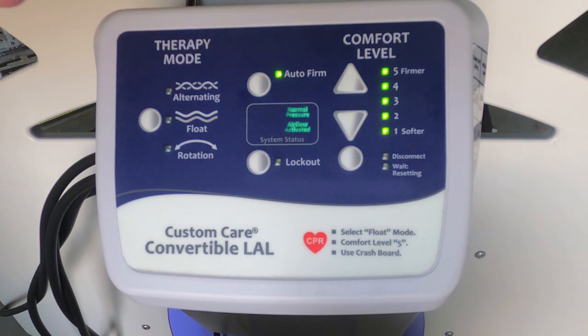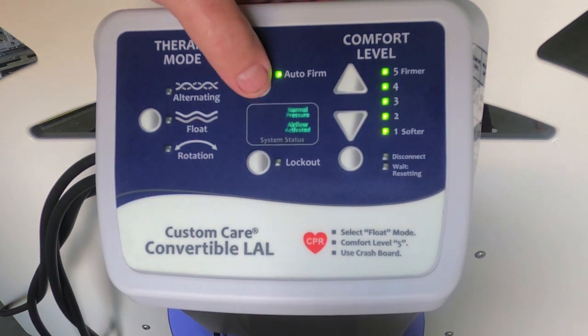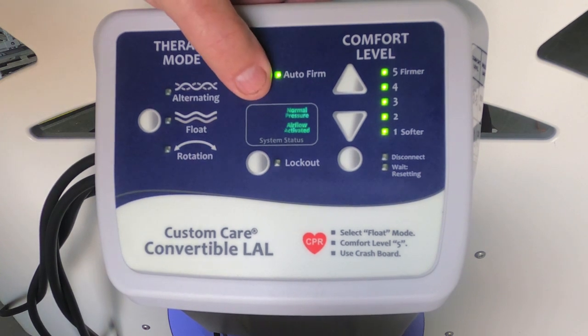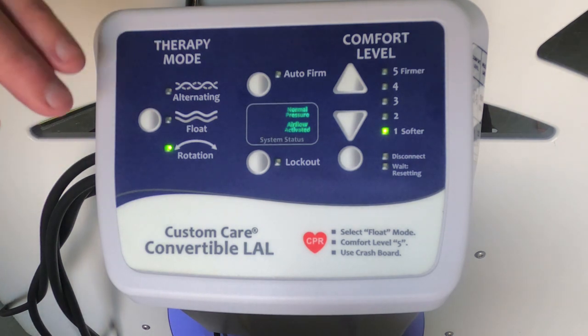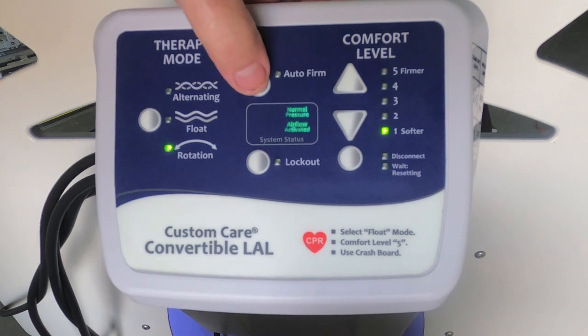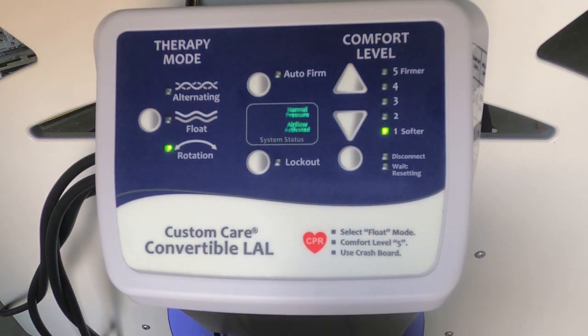When it's engaged, the auto firm will stay on for a 30-minute period of time unless you manually disengage it. So when you engage it, 30 minutes on, disengage it, it's off. If you leave it in auto firm and fail to come back, it will automatically default and disengage, and the system will return to its previous setting. And that was a setting of 1 and rotation of 1, and I can demonstrate that again. Setting of 1, rotation, okay?